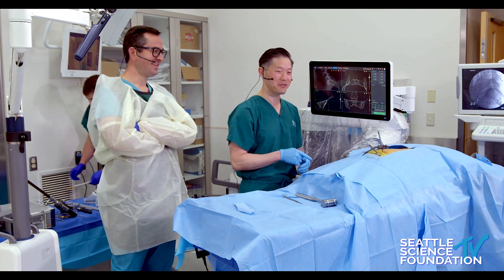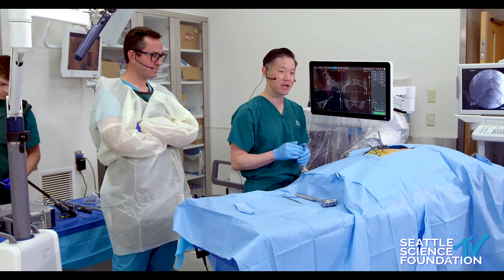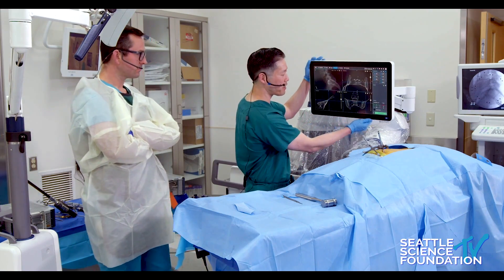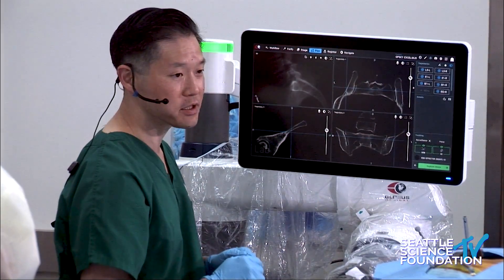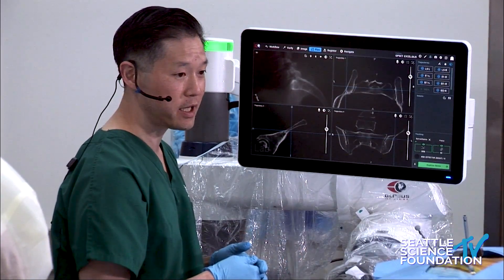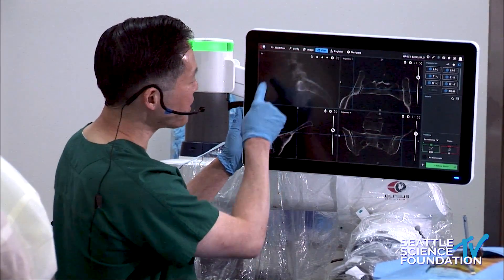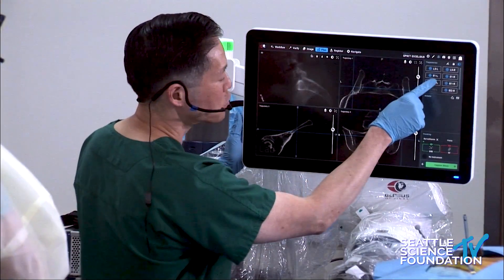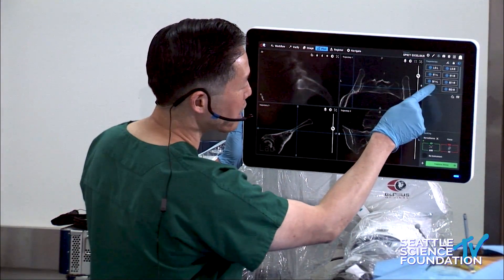Abe is going to demonstrate doing the fusion. You can see it is a very straightforward operation. Once we plan it, it'll be a 10-minute operation, skin to skin. The robot is your best tool for doing that. Here's a typical planning station screen after registering the pre-op CT — we have a synthetic lateral view and trajectory views.